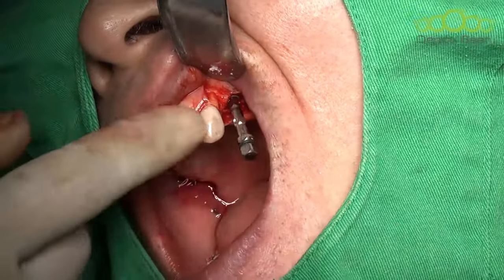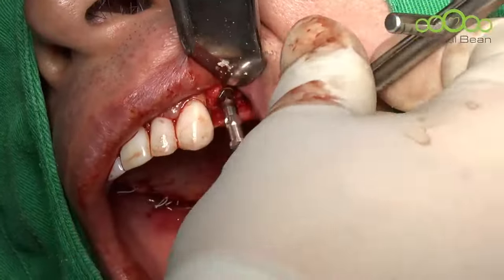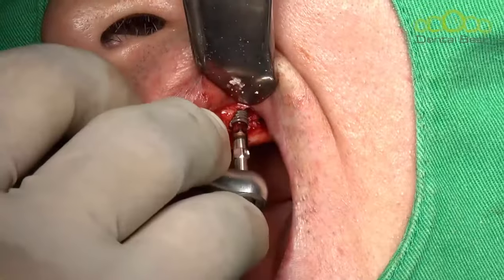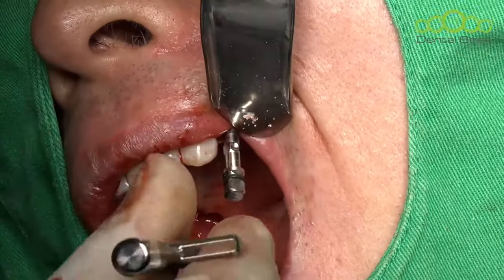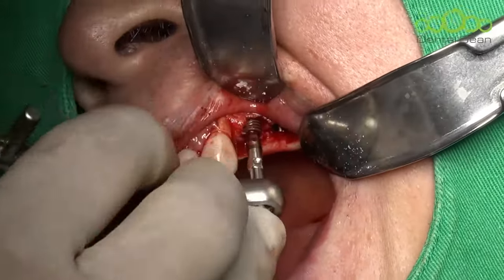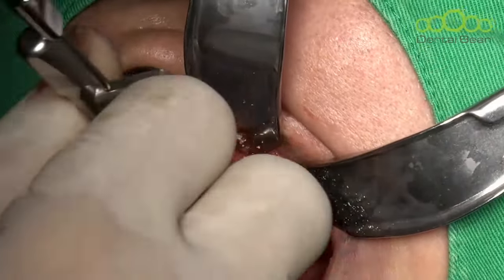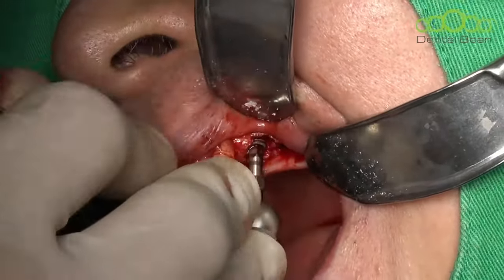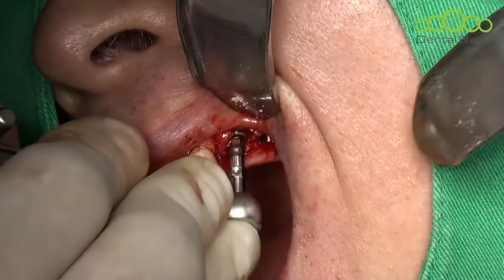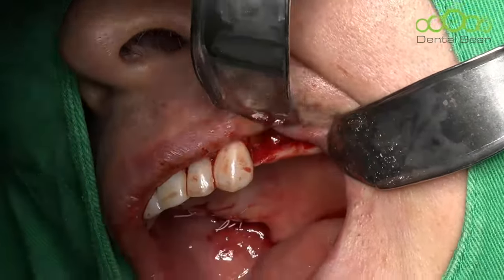This path looks not good. This is not a good path. I have to control this path. I'll remove this one. And then turn it, pass medially. Okay. Keep in mind that the path of the root must be tilted medially. The canine is usually tilted distally, so I'm keeping in mind the canine axis, but it's not easy to control in this case.